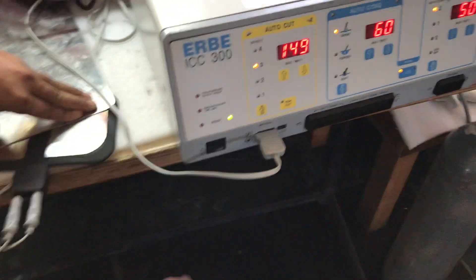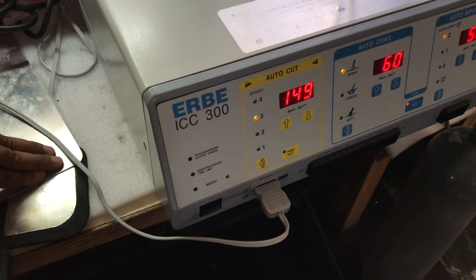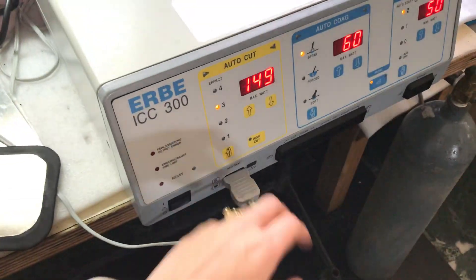The green light shows the patient plate has been detected, and that's the metal reusable plate connected at the monopolar port.